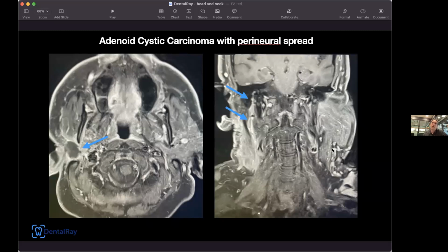Obviously, a cone beam CT scan performed at the point of care isn't meant to screen for adenoid cystic carcinoma. It hasn't been validated to screen for that type of test. But when you scan enough patients, some of these things are going to be on the scan. It's really critical to identify these fairly aggressive tumors as soon as you possibly can, when it's a lower grade and they can be addressed with a better prognosis.